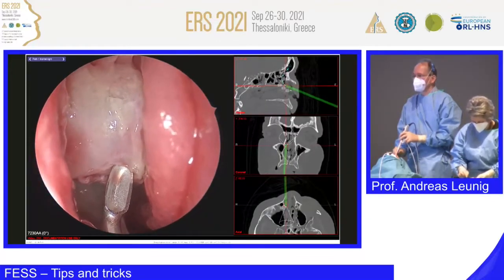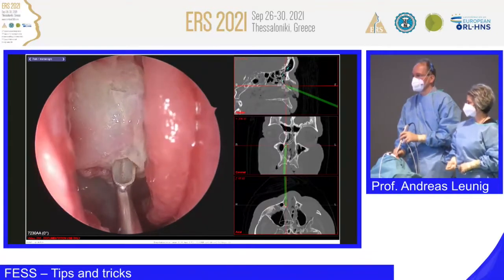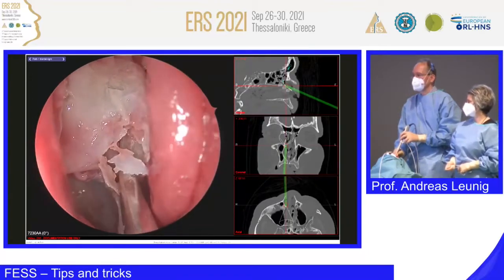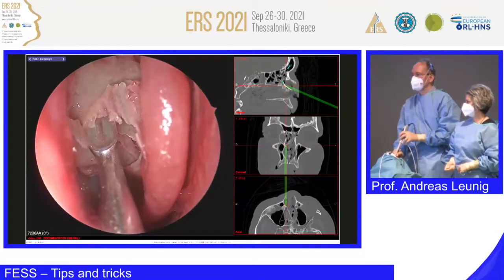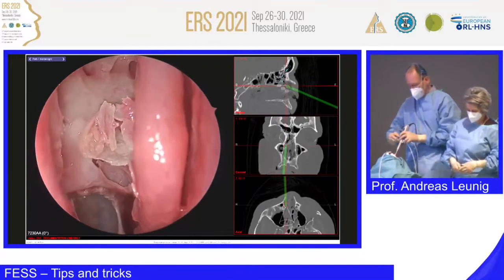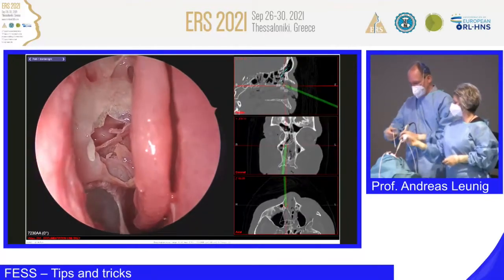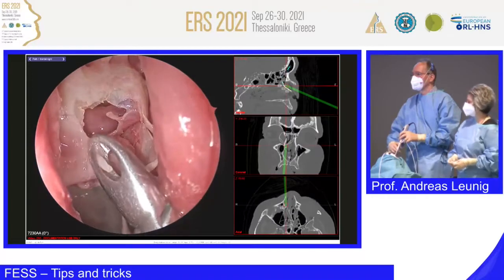So now, the best way, and my favorite, how to resect the ethmoidal bulla is, I stay medially and inferiorly, I pierce here. Now, I'm looking for the lumen of the ethmoidal bulla, and it seems that I'm already in the ethmoidal bulla. I do it gently so that you can understand how we should use the next step. So I break a little bit, I luxate these tiny bony lamellas. So now, Blakesley please. Now we have a Blakesley, the side biting instruments, the backbiter. Now we are taking the anterior face of the ethmoidal bulla, but we try to leave the basal lamella of the ethmoidal bulla in place.